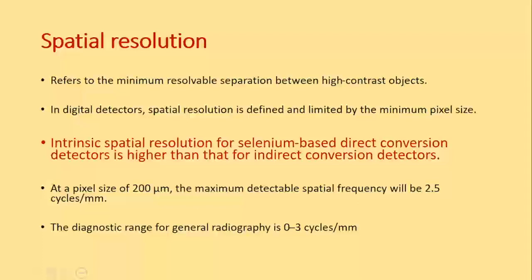So CT is literally blind. Hence, you would not take a CT to look at root canals, but you'll still stick to intraoral periapicals. Similarly, you will not take a pan for a periodontal ligament space assessment. Why? Because it's blind. You'll again go back to intraoral periapical.